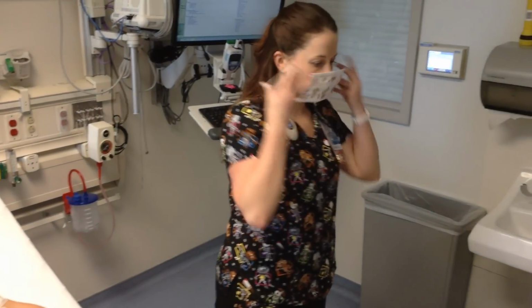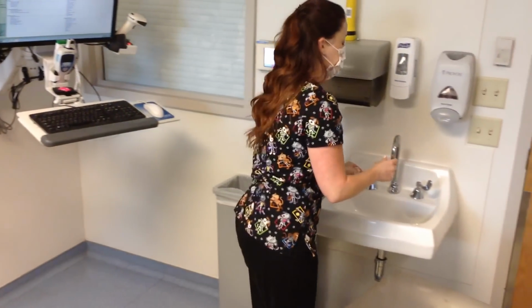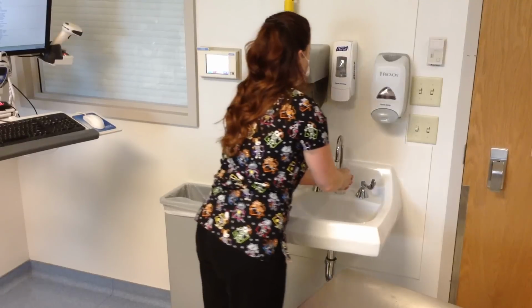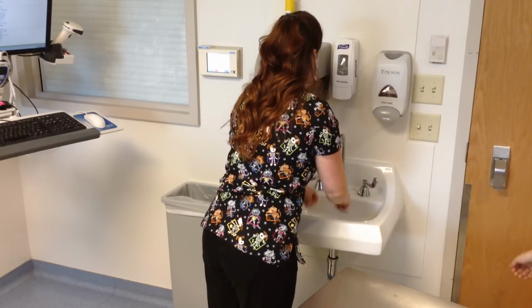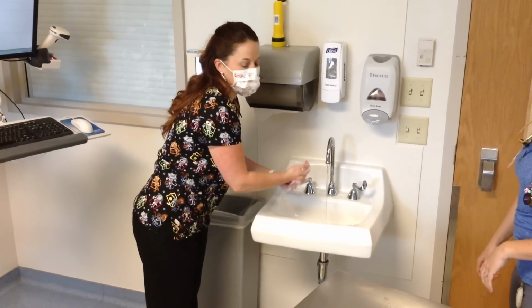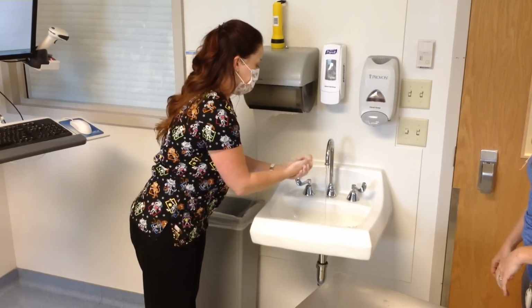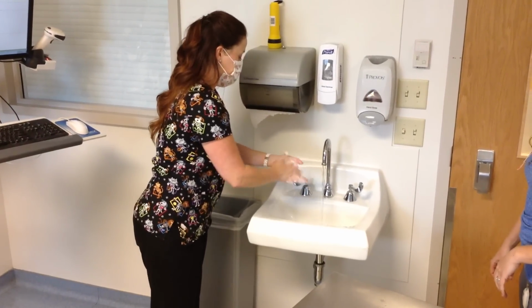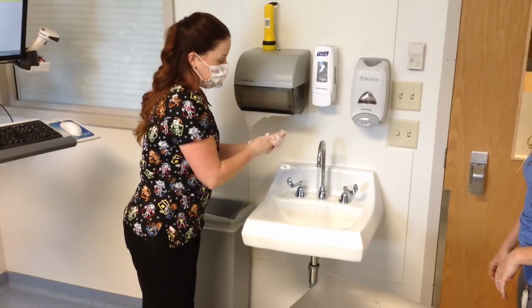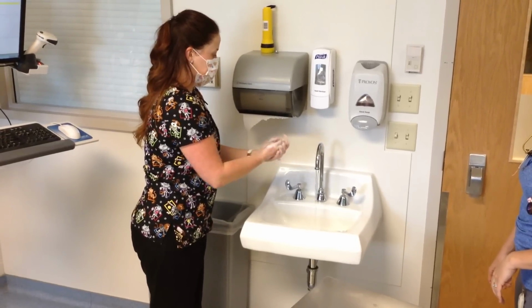And then as our work surface is drying, me and my sterile helper will make sure that we perform soap and water hand hygiene. Anytime prior to doing any sterile procedure, we expect a soap and water clean. And then your subsequent hand hygiene in between steps can be hand sanitizer.